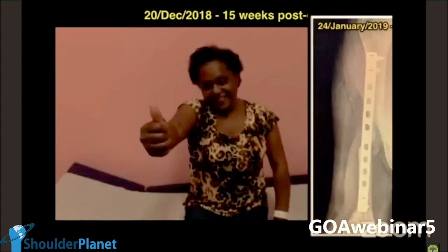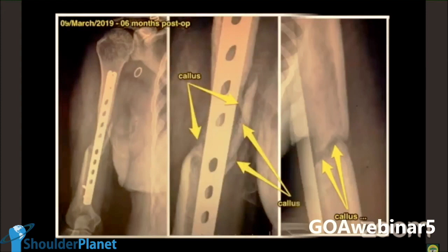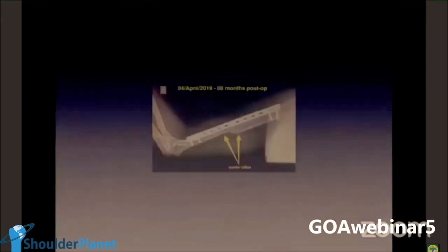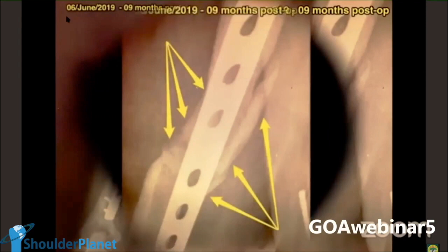But when will callus come? You see, on the AP, not much, but if you follow these patients, the callus started to appear after six months. If you keep on following her, a lovely callus, 8 months on the left view. And then what about 9 months? Now we have callus and callus and callus and callus.